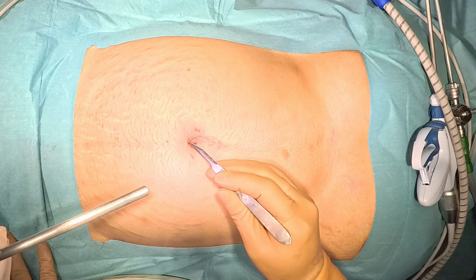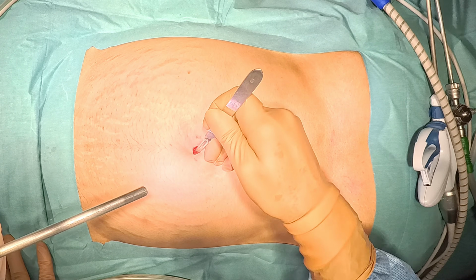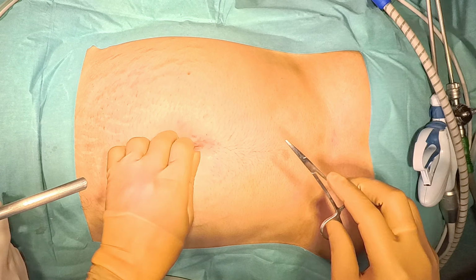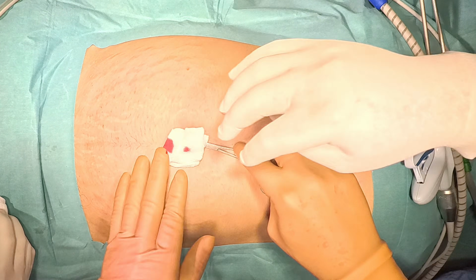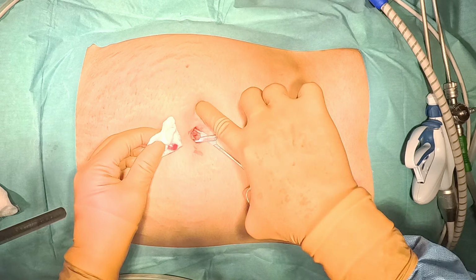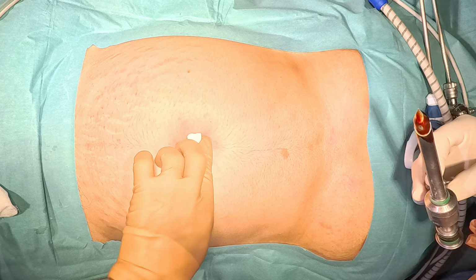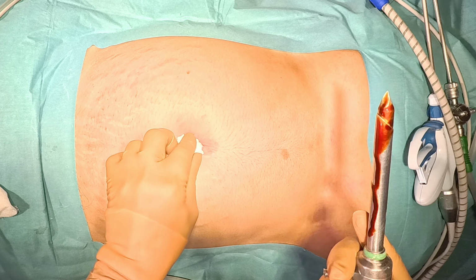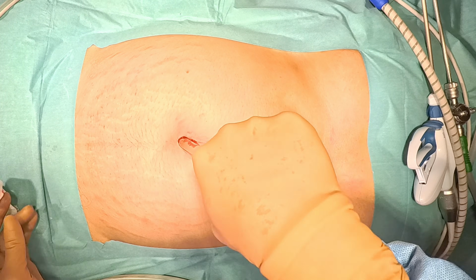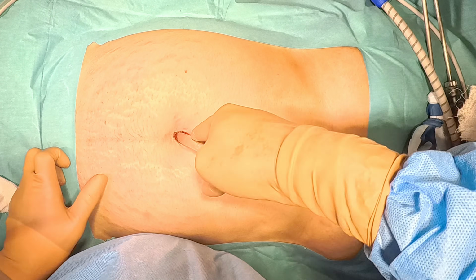After that, we will extend the incision to 11 mm. This is a smiling incision. We should increase it on either side in a smiling fashion and then we will dilate the obliterated vitello-intestinal tract, which is a part of the Scandinavian technique. Then this is the 10 mm trocar port with a little bit of betadine over the tip, and then we will introduce the trocar.